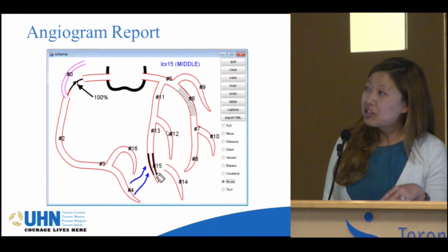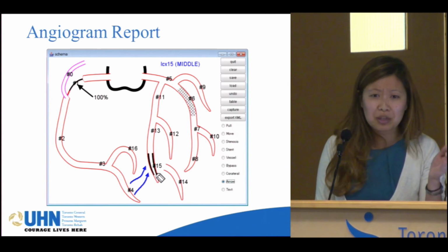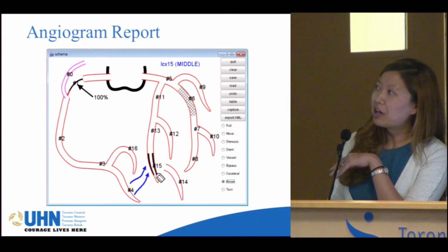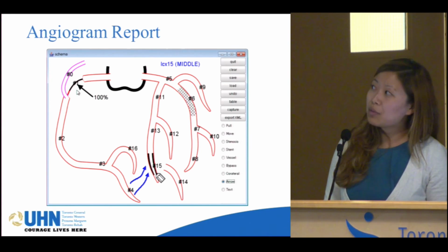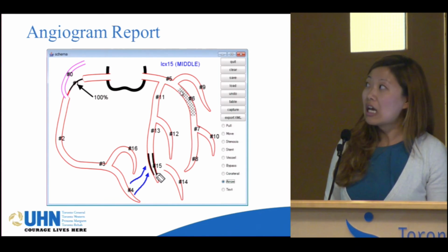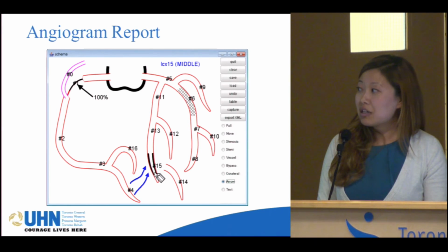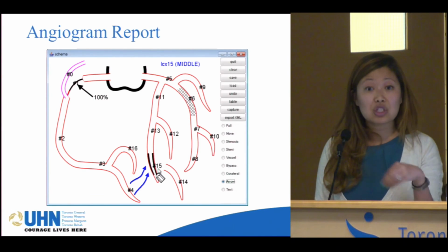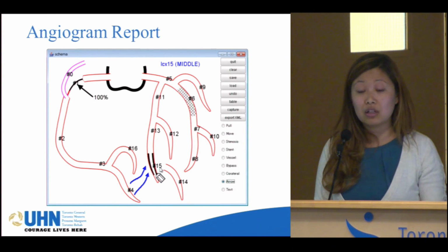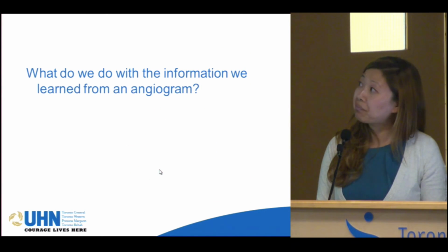Now, you might get this image. Some of you guys get this image that we always ask for. Did they give you a picture? This one's a very crude drawing, but then they let you know, okay, this part off the right coronary artery, there was 100% blockage of this person. This one, they had the intervention. It's a stent. And then down here, they might not have been able to get to it because it's too small to put either a stent or to do a balloon plasty in it.